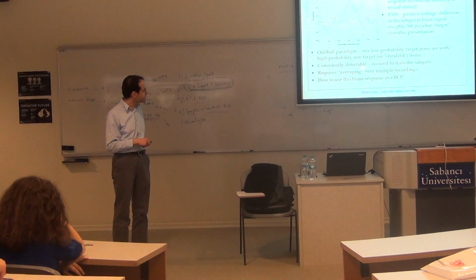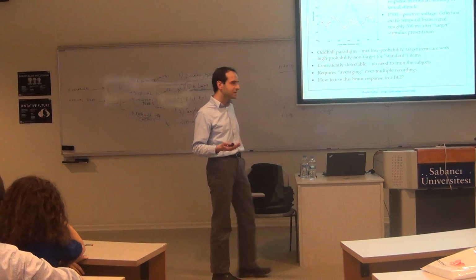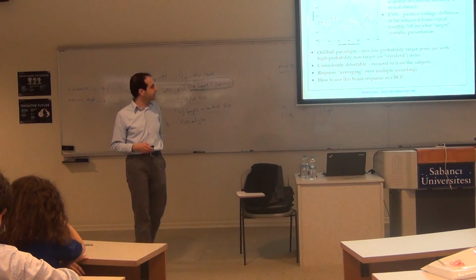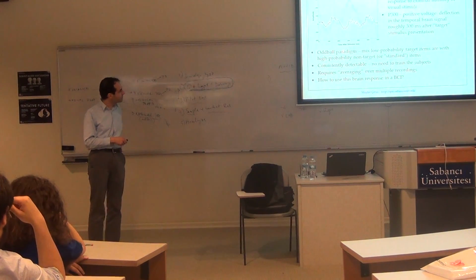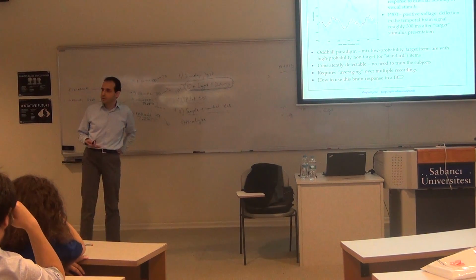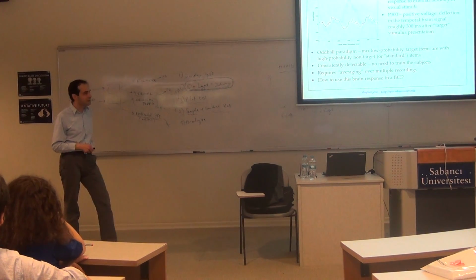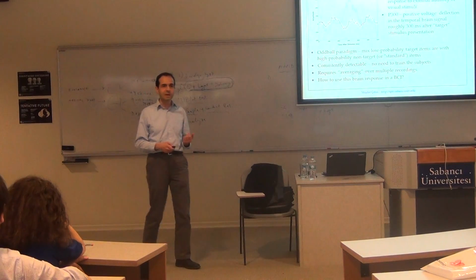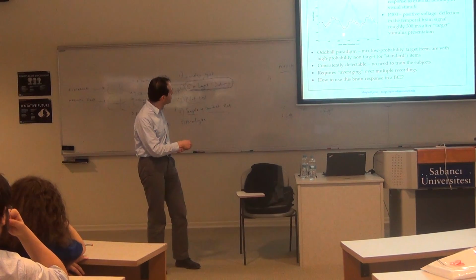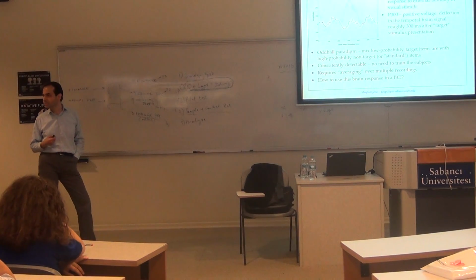The interesting thing is that this is consistently detectable. We are already generating these, so to be able to use a BCI, you as a person don't need to be trained. You just sit there and you generate this anyway. So it's very convenient in that sense. One problem, as in many parts of EEG signal processing, is that the signals are very weak, so this requires averaging over multiple recordings. With just one recording, you may not be able to detect this well, but if you repeat this, let's say 10 times, then maybe you will have a clear pattern of difference. So that's a very well understood brain response.